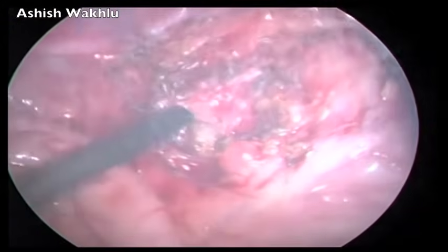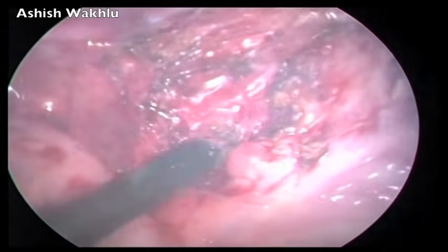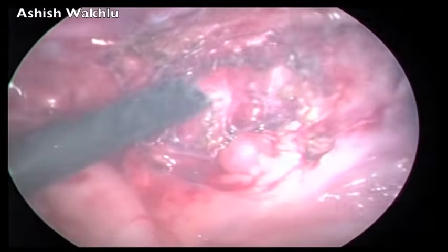And finally, the gap appears, which gives a way through to the other side.